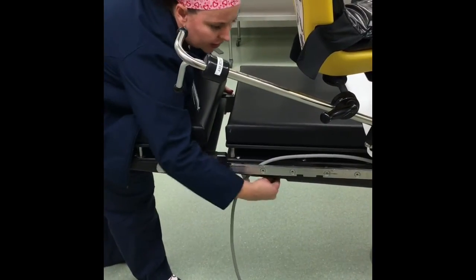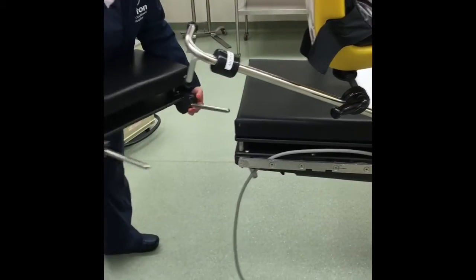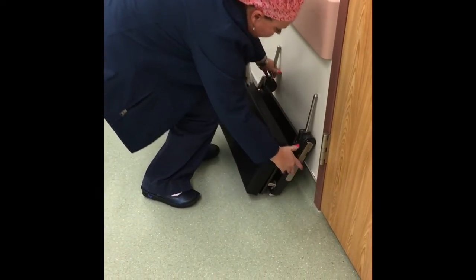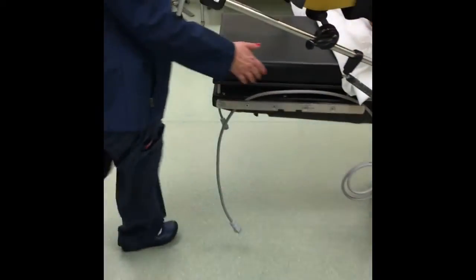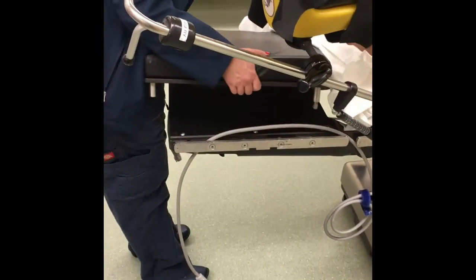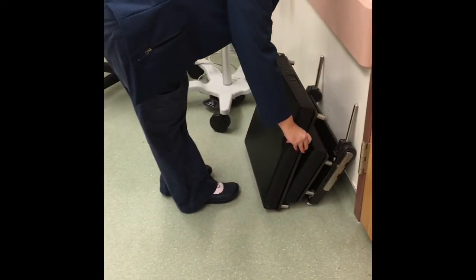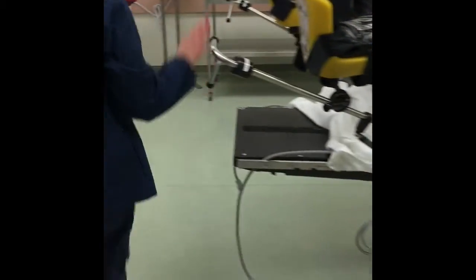So again, you undo the hook and put this off out of your way. And then you'll remove this section. And off out of your way. And then you would ask your anesthesia provider to please go down at the foot of the bed.